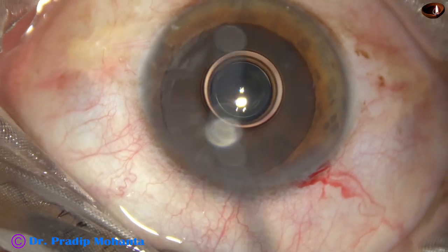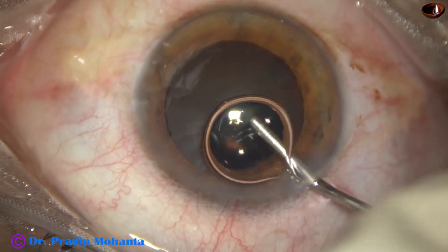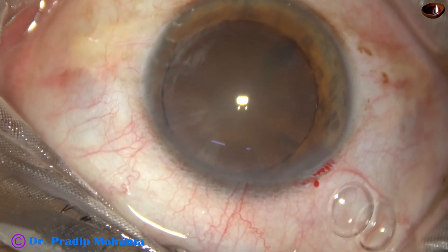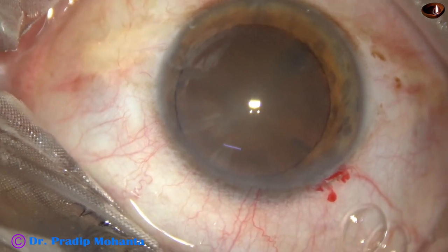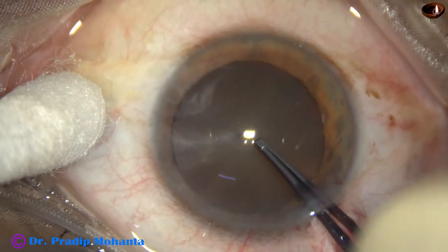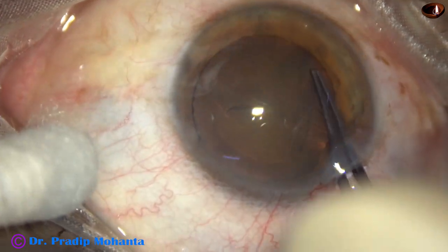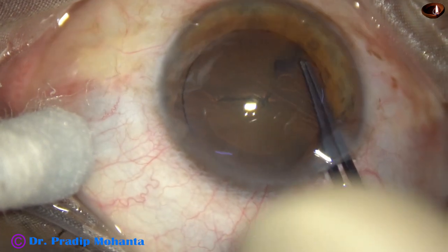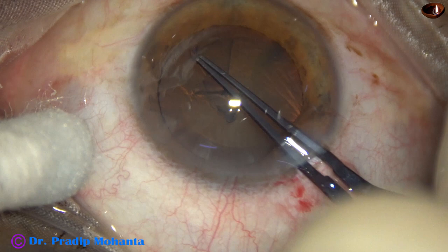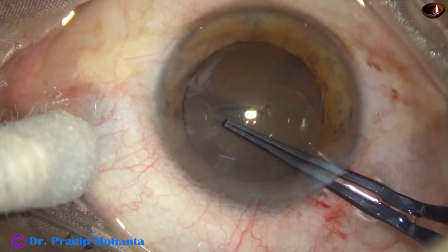2% hydroxypropyl methyl cellulose is now used to fill up the anterior chamber. Capsulorrhexis is done with the help of Utrata forceps. The capsular tag is raised and guided anticlockwise all around to get an adequate size rhexis of about 5.5 mm.